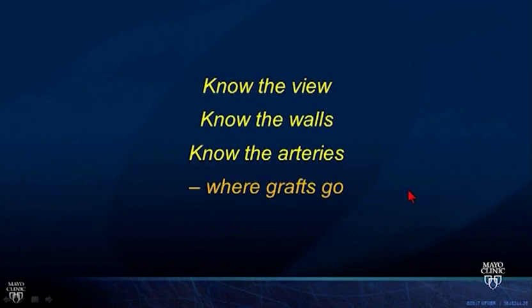So if you know the view and the walls and the arteries and where the grafts go, then you can also know where the collaterals go. So it's really adding up all those things in a stepwise approach. Let's talk about coronary anomalies.